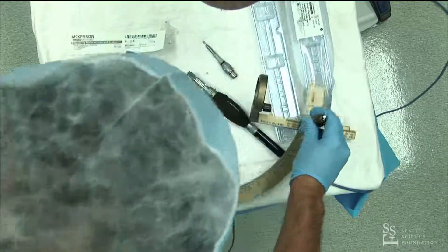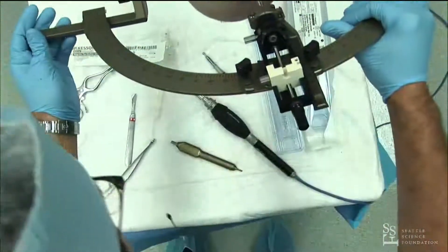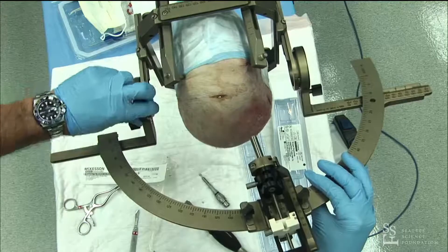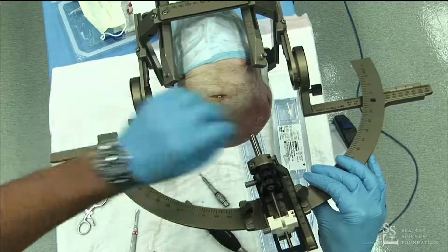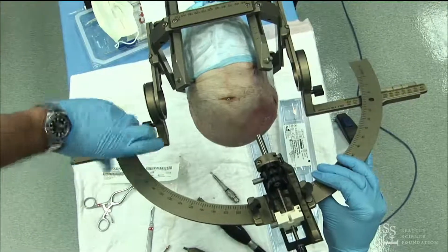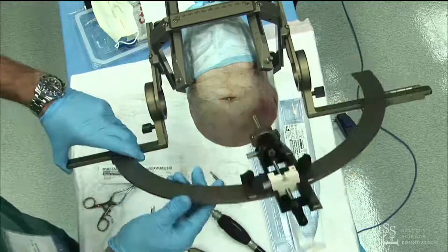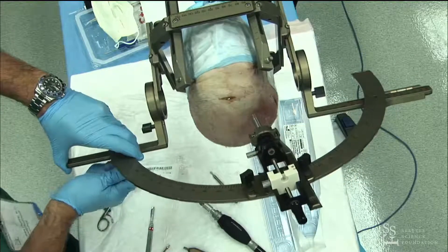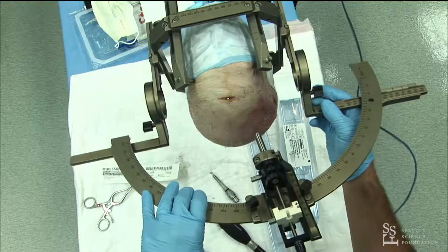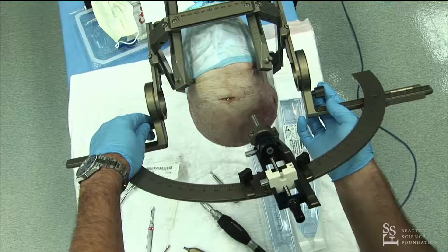Now we've got our XYZ and our arc. The only thing left is our ring. It's got a little notch to line it up on both sides. Loosen this, keep some tension, and it clicks in. Make sure everything looks flush — there's a lot of room for little gaps that can affect your accuracy. And then our last coordinate is the ring: 54.7. A little bit anterior on our cadaver.